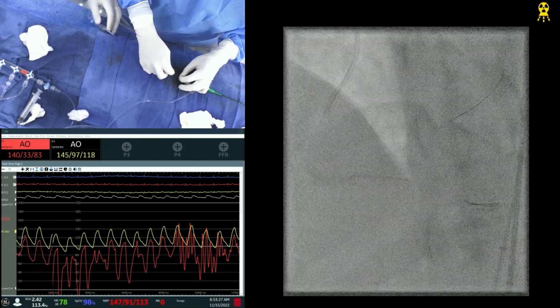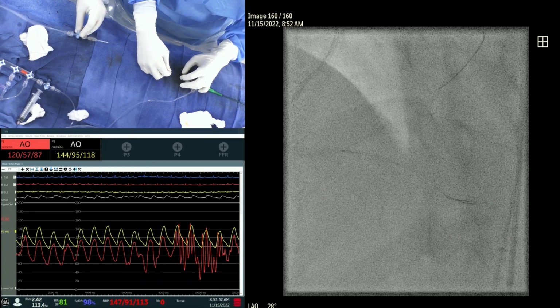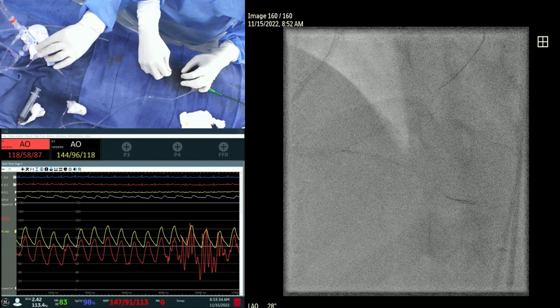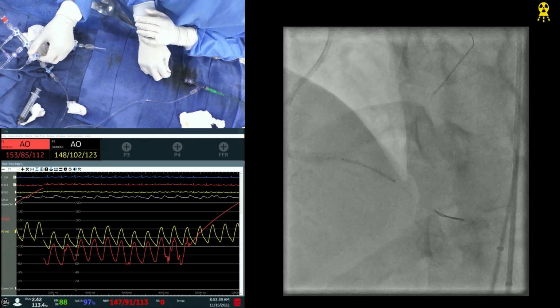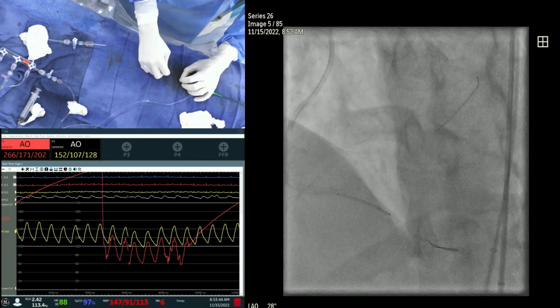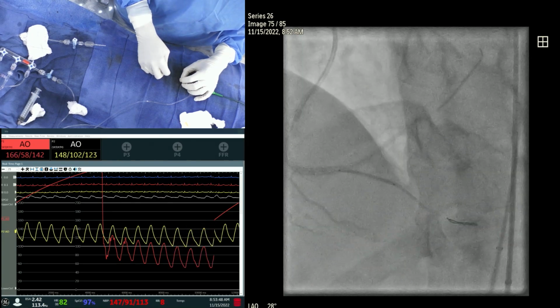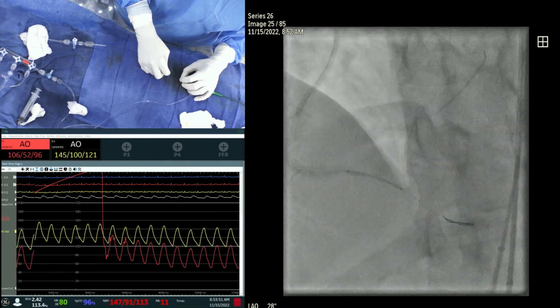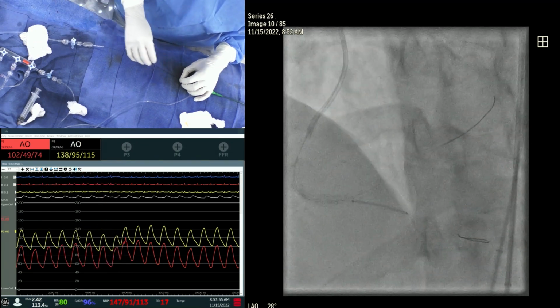Let's put the wire back first. One second, let's attach one before we take a picture. I think it's good to show provisional stenting. Want to pull back 1 millimeter? Good, go. Yeah, good. Ready? You want to put a second stent or no? 2.5. Yeah, 2.25 by 12. Yeah, believe me, we'll go through the 6 French. Let's give it a try.